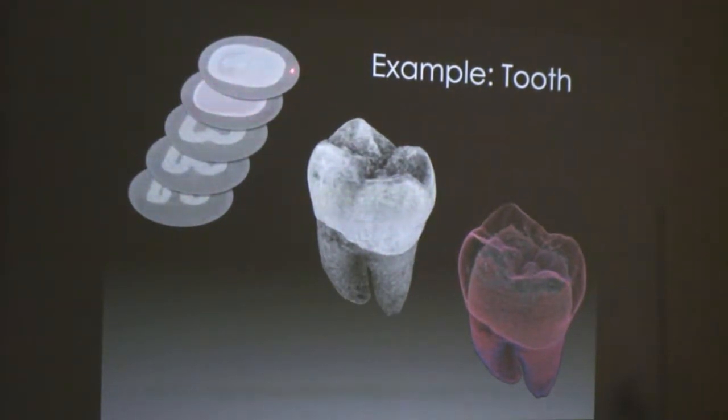So say, if your ray samples here, you can design a transfer function in such a way as to say, this should be completely transparent. So this is air. You don't want to see that. And that's why you see nothing around the outside. But then if you sample in here, which is the tooth itself, then you can give it a different color.